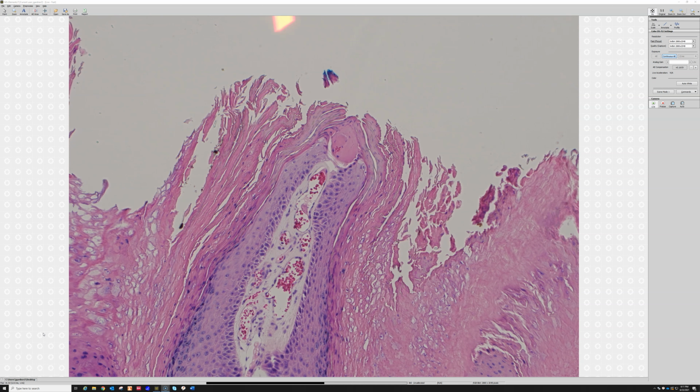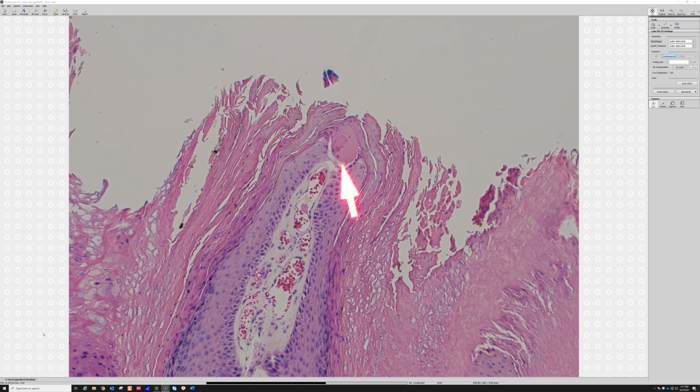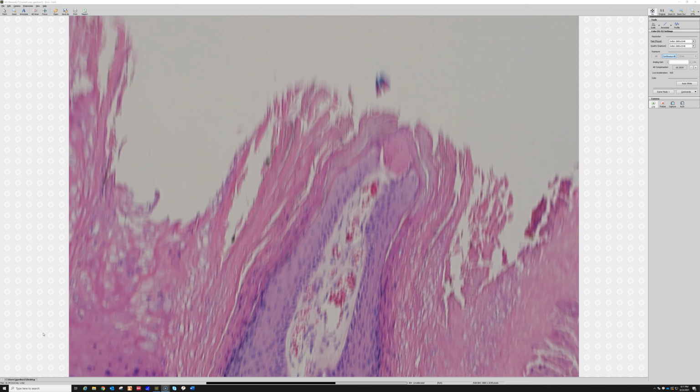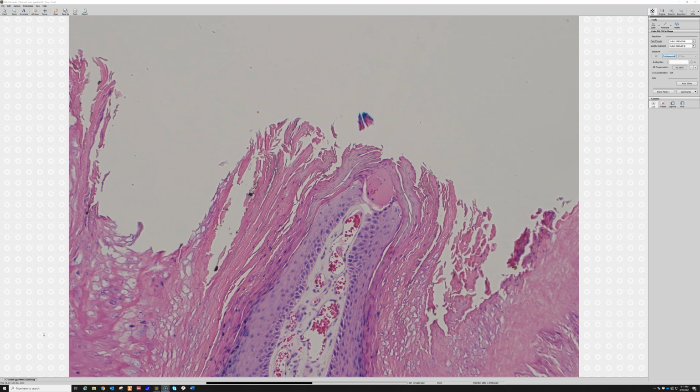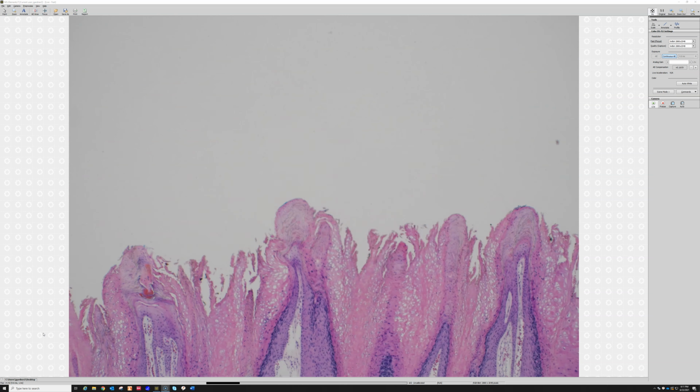And then look, oh, we're seeing it right in the act. I'll show you something in a minute, but here's where it starts. Blood and fibrin get present over top of these tips in the middle of the spires of parakeratin. And the reason that happens is these blood vessels up here are right next to the surface. And so if there's a little break in the epidermis there, blood comes leaking out, and then it congeals and coagulates and makes a little fibrin aggregate there, okay? And so those get trapped in the papillary dermal tips, and that's a really helpful feature that's often present in verruca, okay?